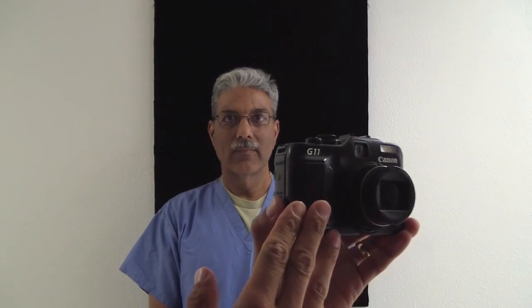So we're going to be using my resident contemporary, Dr. Insani, and I'm going to show you just a few little tips that I've been taught and Dr. Insani's been talking about, just as between takes. I'm going to be using my simple G11 camera. Of course, these are basic photographic principles, not advanced. And if you have a different camera, I hope that they will apply.